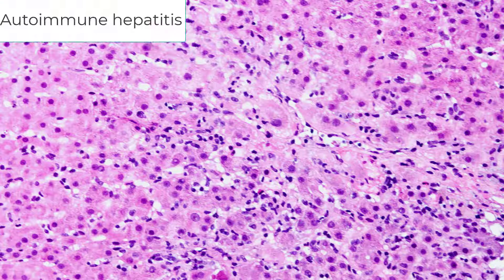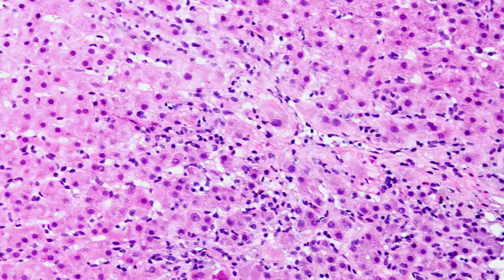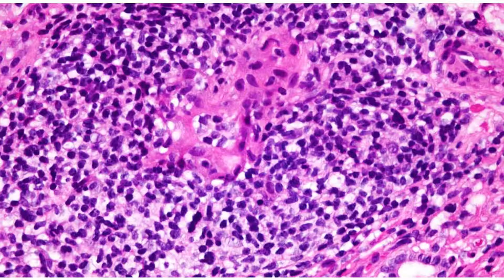This is the same case of autoimmune hepatitis. This time the inflammation is lobular. Often in autoimmune hepatitis you'll see centrilobular accentuation of the inflammation, and I find that a very comforting feature of autoimmune hepatitis. You tend not to see that in PBC.